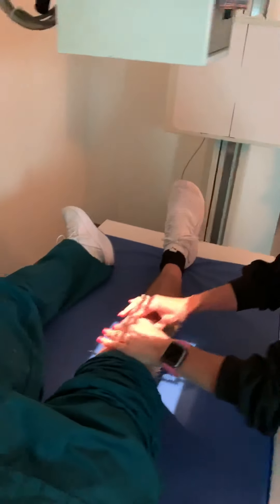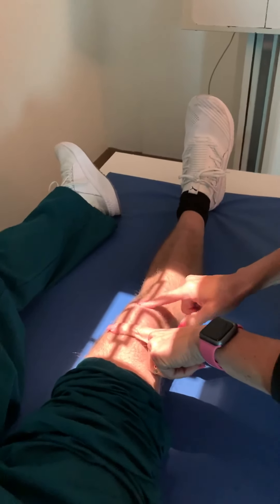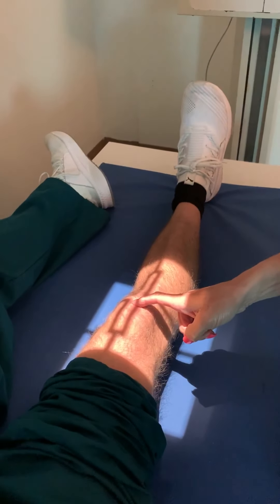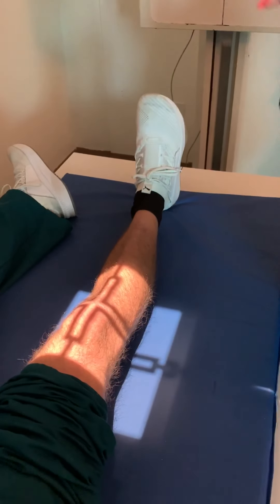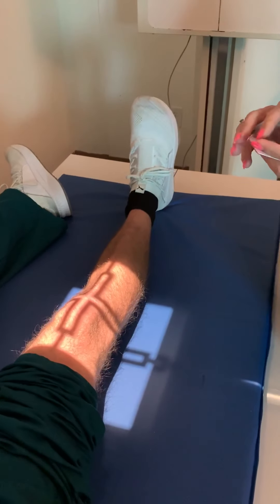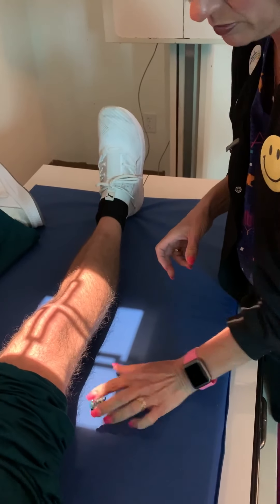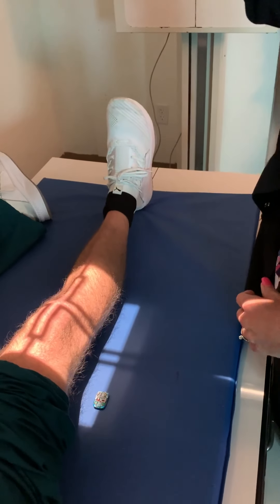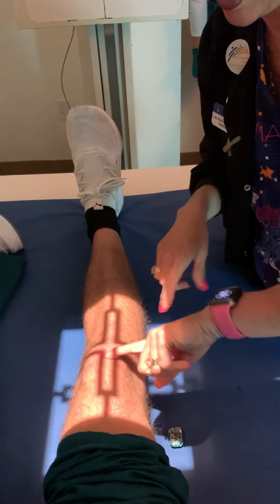We're angled and aligned to the bucky. We're going to find the apex — this is the base of the patella, and this is the apex of the patella right here. Central ray is one half inch distal to the apex, center of the knee. That looks pretty good. I'm collimated to a 10 by 12 portrait, or lengthwise.